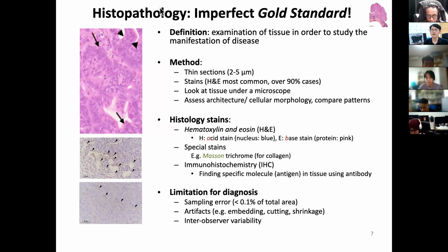However, this is the standard of care, and this is why optics is trying to conquer this area. Let's say I'm suspicious that I have esophageal cancer. So I go to a doctor, and they will go through my esophagus.